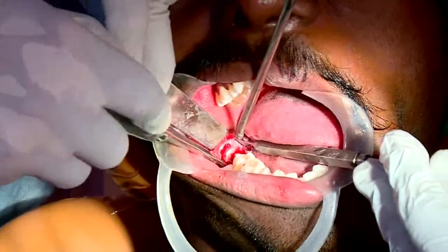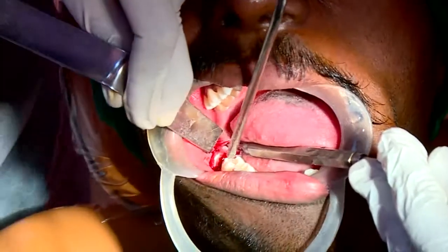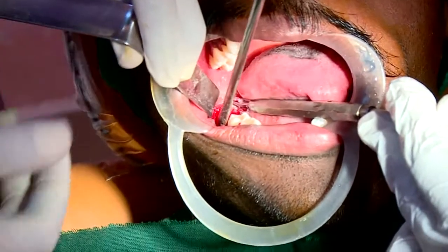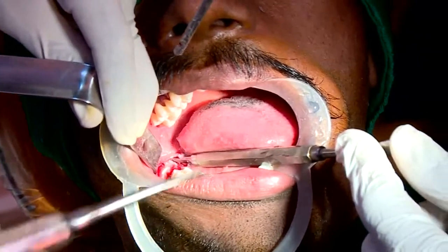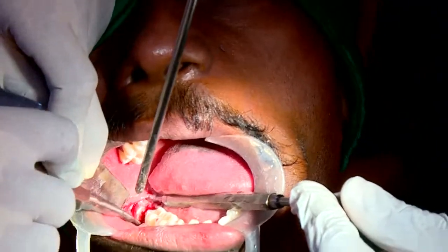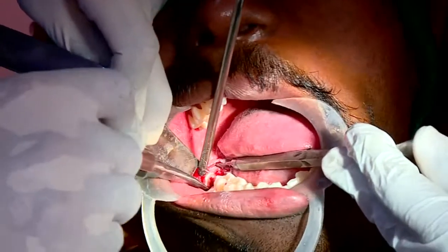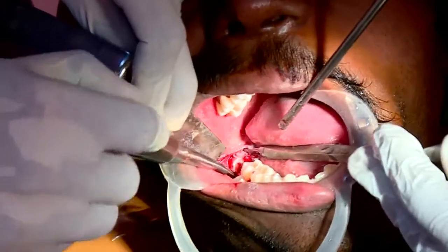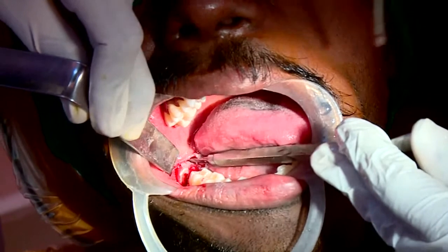Still very comfortable, not having any pain or discomfort. So always evaluate the amount of loss that is there in a tooth. The easy way is something called the arc of rotation, which you can try when you see an IOPA in the department.